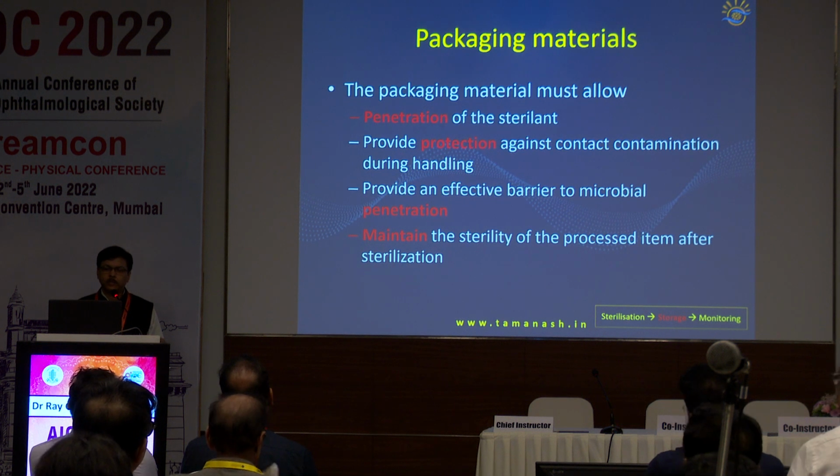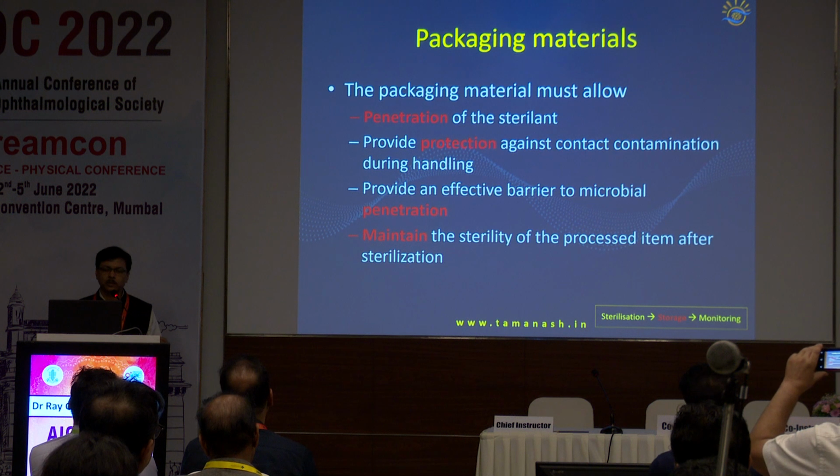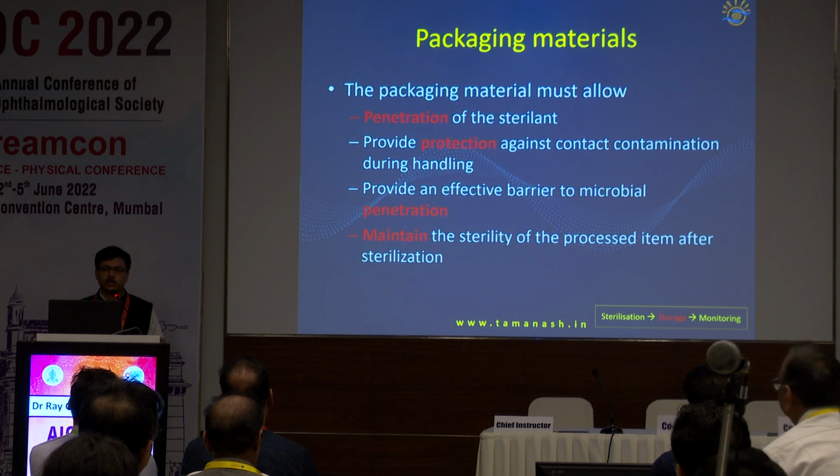So the packaging material must allow penetration of the sterilant, whether steam or ethylene oxide, and it must protect against contamination. So it should not be easily penetrable, so that the instrument cannot mechanically come out, and it should maintain the sterility of the processed item after sterilization.